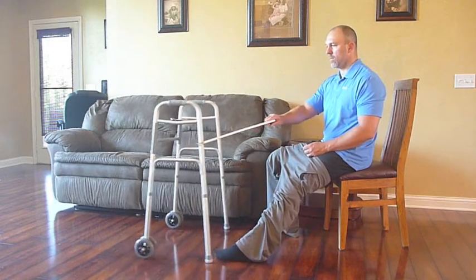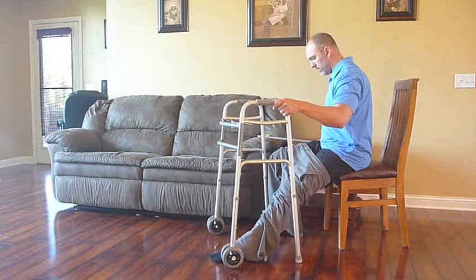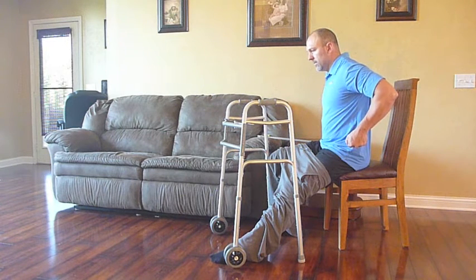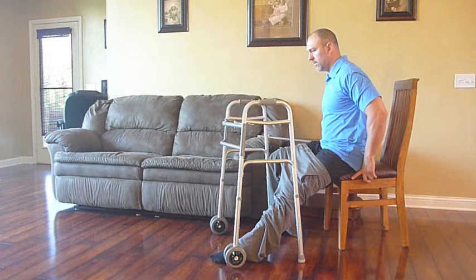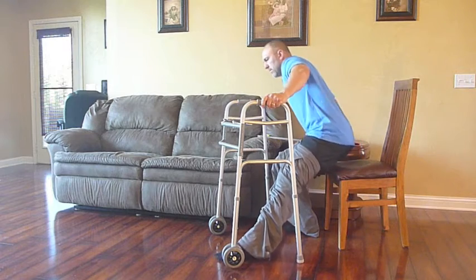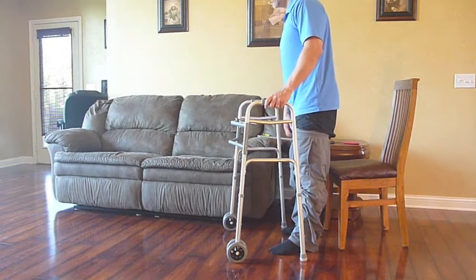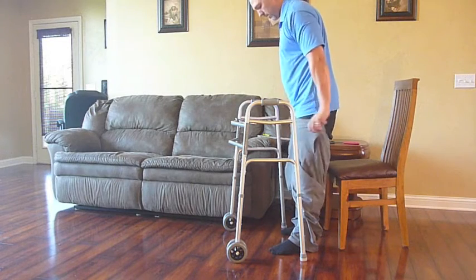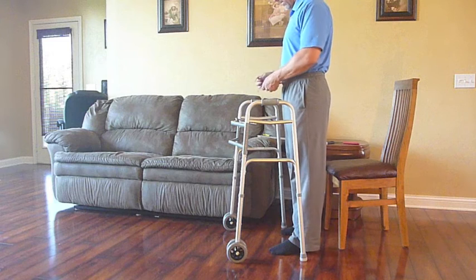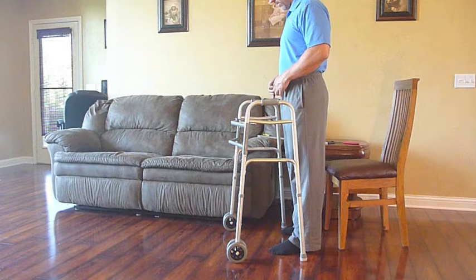You can also use your reacher to bring your walker in close so as not to lean forward. If it's available, you'll always want to use a chair with arms on it to make it easier to get up and get down. Since we don't have arms, we'll lean to the side and use the strength in the good leg and the arm on the walker and a firm object with the other arm to push yourself to stand. Elastic waistband pants work the best as they have a decreased tendency to fall as you go to stand.